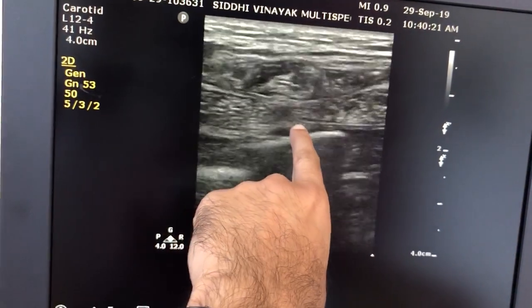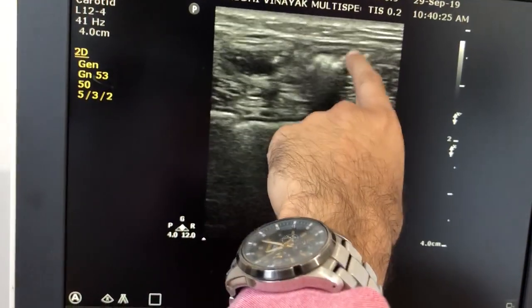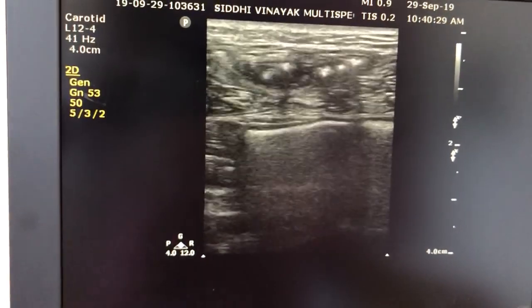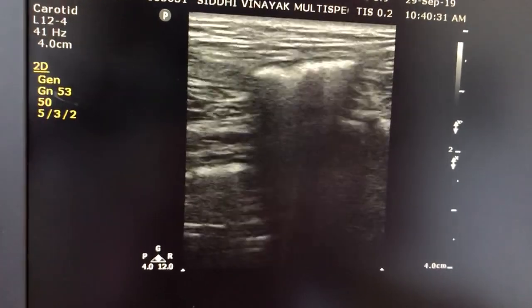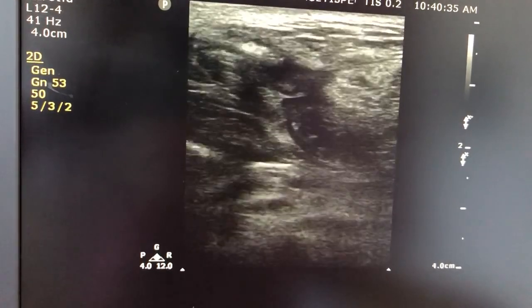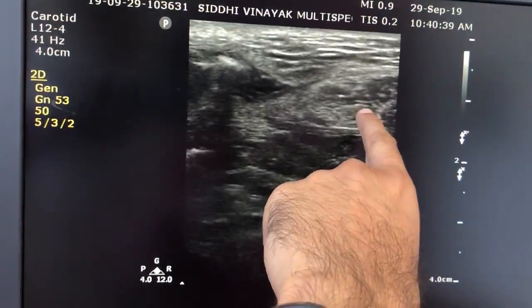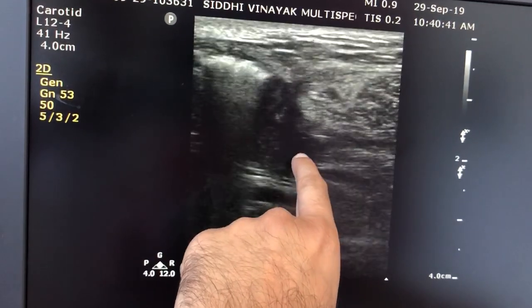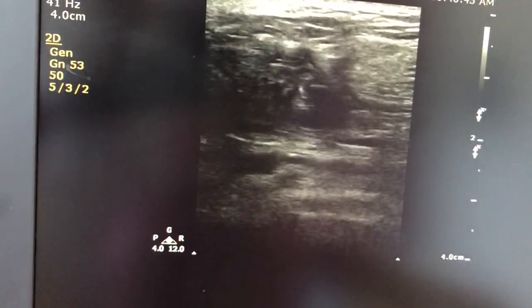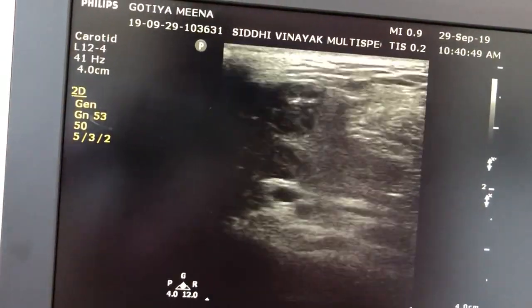Now inferiorly here we can see once again this linea alba, but what we see above this linea alba is the small bowel loops, which are located superficial to the rectus muscle, which is not their usual location. And here, yes, you can see this gapping. This is the left rectus abdominis, and medial to this margin there is a gapping and herniation of the intestinal loop, small bowel.